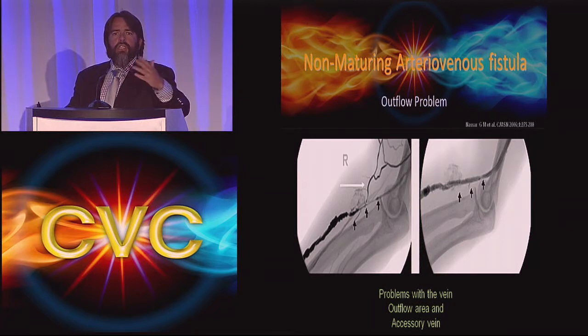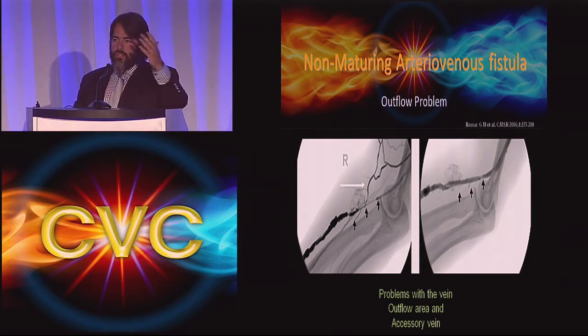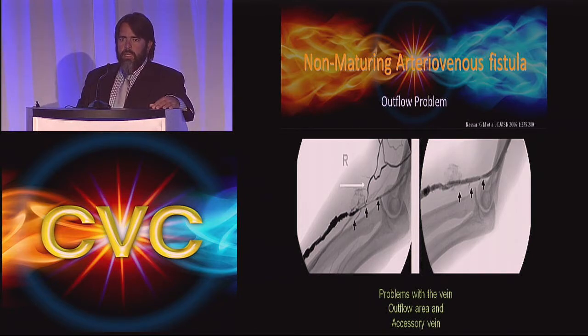Then consider doing an angioplasty of the area with open angioplasty. Just put a little patch there, open it, and send it back to the surgeon. He might be able to fix that, and you might be able to give more life expectancy to that fistula.